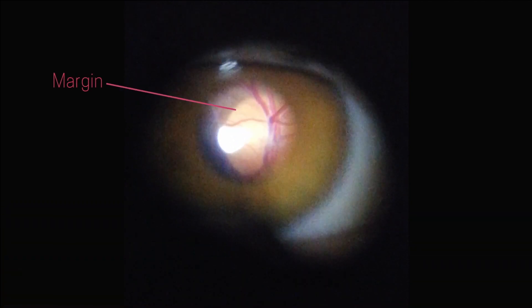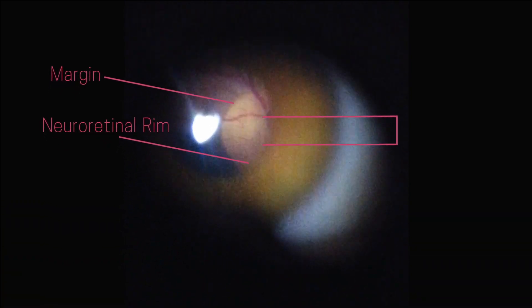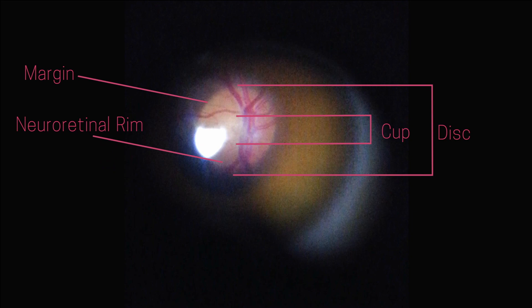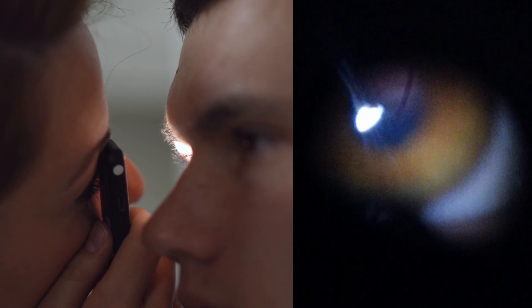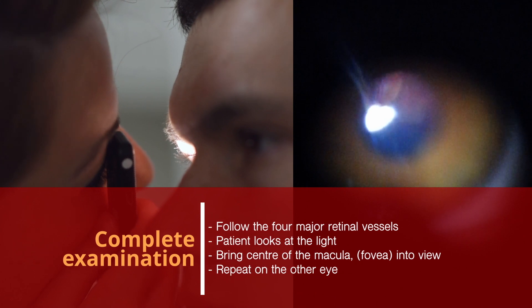Comment on how distinct the margin of the disc is, the colour of the neuroretinal rim, and the cup to disc ratio. Then look for other signs along the four major branches of the retinal vessels.